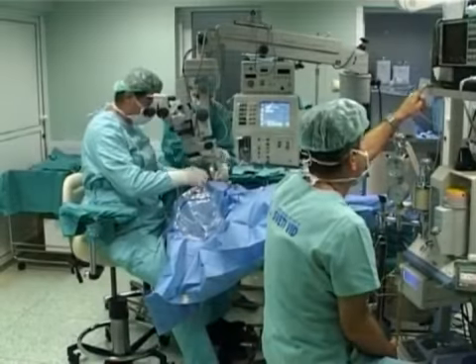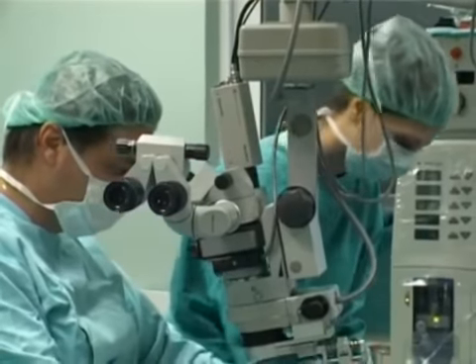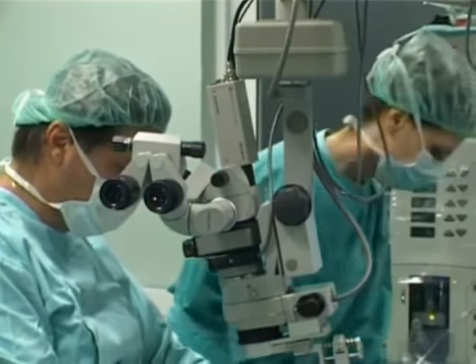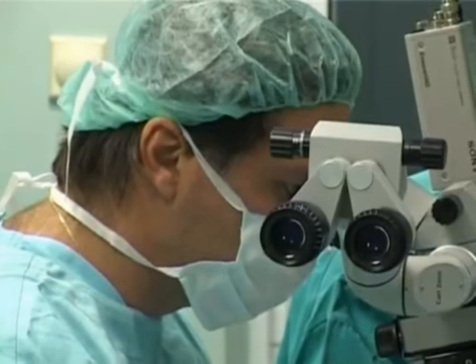Around a decade ago, Sveti introduced posterior segment surgery in these areas, thus introducing a less invasive approach with the so-called 25 and 23 gauge surgery, which has become applicable today as a surgical approach in posterior segment surgery.